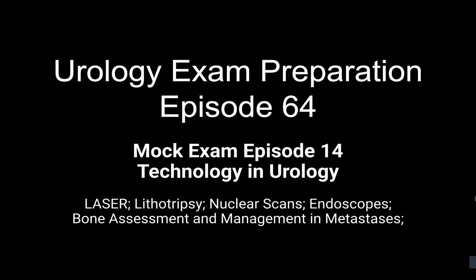Okay, what is the use of MAG3 renogram in normal urology practice? So it can be used to determine the split renal function, to determine if there's an obstruction in the kidney, and then it also helps to determine the level of obstruction, and it can also be used as an indirect test for vesicoureteric reflux.